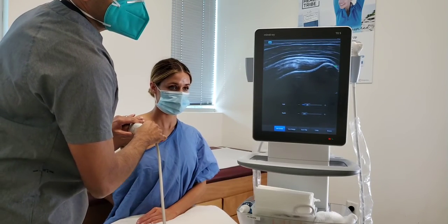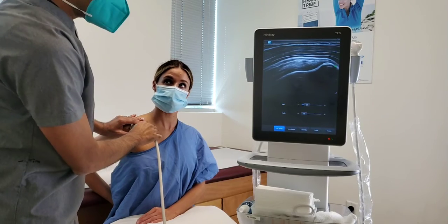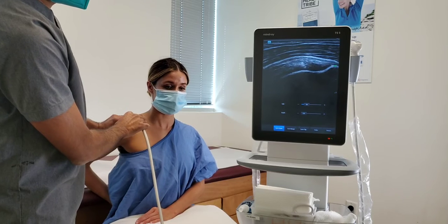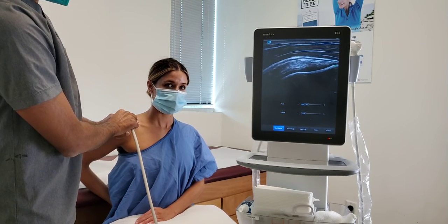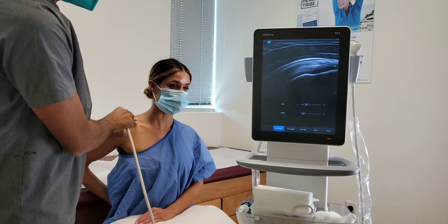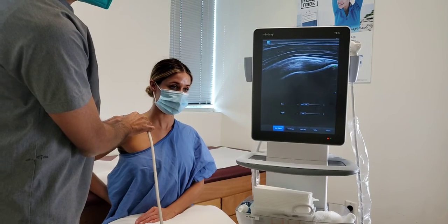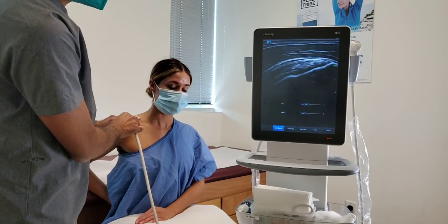Now, what we see here is this kind of black line that's on top of the tendon. That's actually a little bit of bursitis, or a little bit of inflammation here. This could be something that has occurred because of an irritation or an injury to the shoulder. This could be a normal amount of little inflammation that takes place after things like working out. But this is something for us to be aware of, because if Lexi has some shoulder pain, then this might be a hint as to what's going on as a part of the picture altogether.